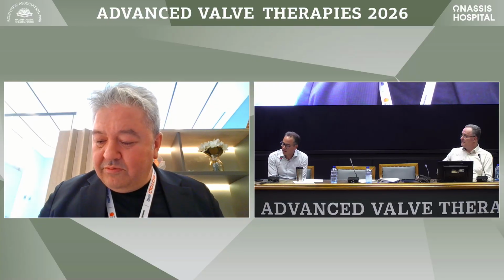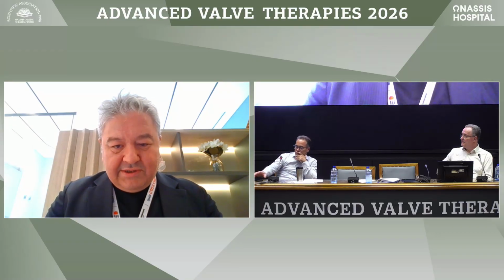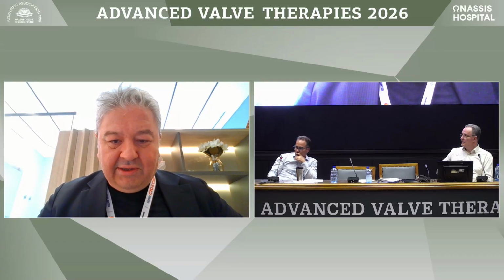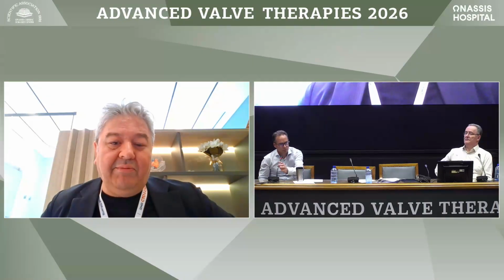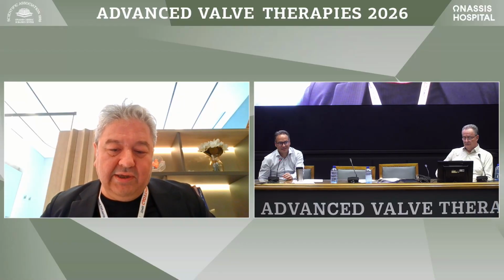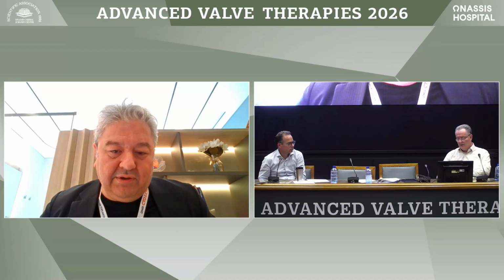First, during fluoroscopy, we look at the opening of the two discs of the metallic valve, and then we only use the wire, not any catheter over the wire. And the Terumo guide wire can easily cross, but sometimes if you cross in an inappropriate region, the blood pressure can fall and hemodynamic problems can be observed. So it's a technique. We also published this technique, with very careful hemodynamic observation.